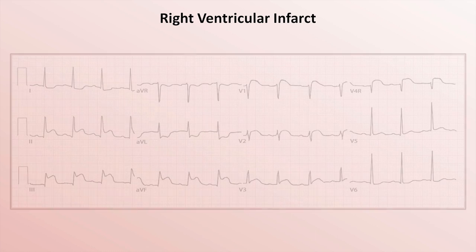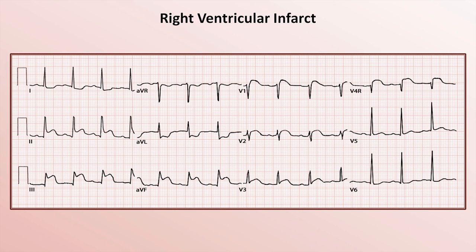This is what the EKG of an RV infarct looks like after doing that. You can see an obvious inferior STEMI. In addition, there is ST elevation present in V1 and V2, with the elevation in V1 being greater than that in V2 — that already strongly suggests an RV infarct. To confirm it, the clinician has included lead V4R, which shows up on the EKG in the same place usually reserved for V4. The presence of ST elevation in V4R confirms the RV infarct.